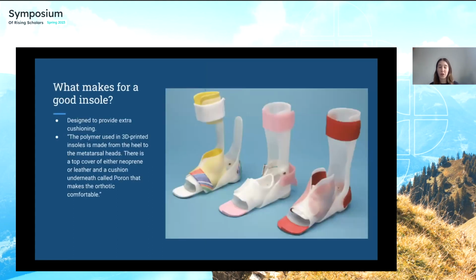So what makes for a good insole? I would say many things make for a good insole. It's really about whether or not the insole is effective or comfortable. I do want to share a quote from the doctor that I worked with and his opinion on the question of what physically makes a good insole. He said, the polymer used in 3D printing insoles is made from the heel to the metatarsal heads. There is a top cover of either neoprene or leather and a cushion underneath called poron that makes the orthotic comfortable and effective.